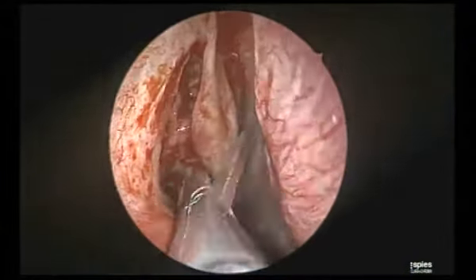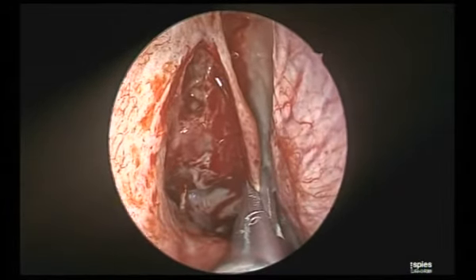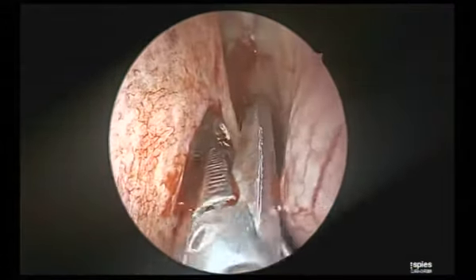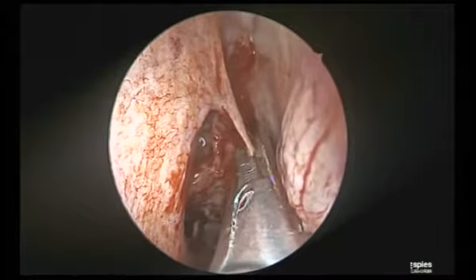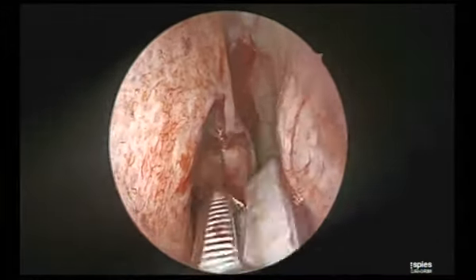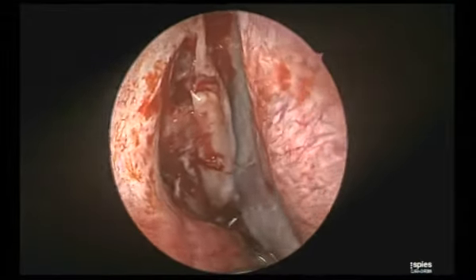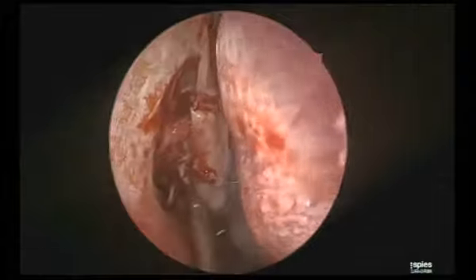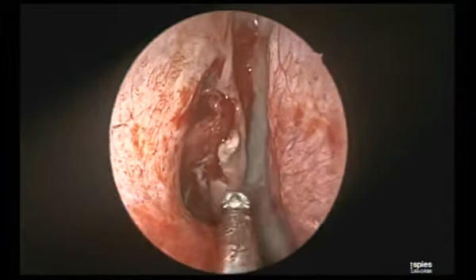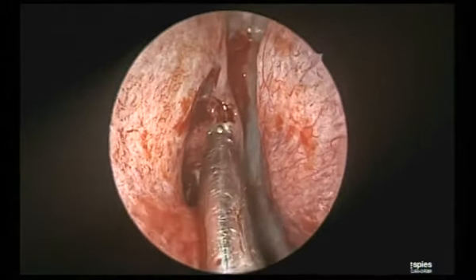Turbinate scissors, true cut. This is not scissors. No, this is a true cut. What did you give, yaar? Look for the turbinate scissors in it. Arvind must be having. This is not the proper instrument. Give me the divider. Leave it. See Ashish, I am removing this wedge of the turbinate. Beautiful. I do it just with a sharp turbinectomy scissor, which I was not having here.